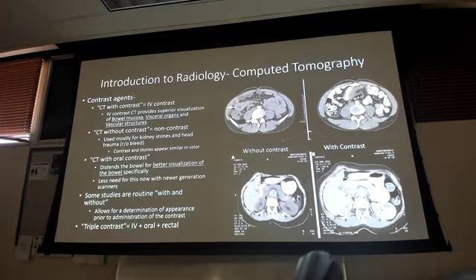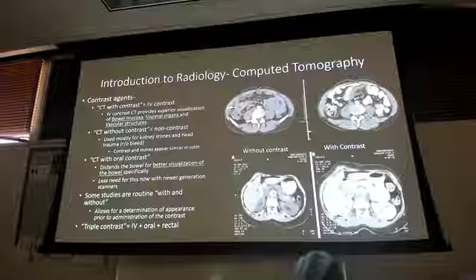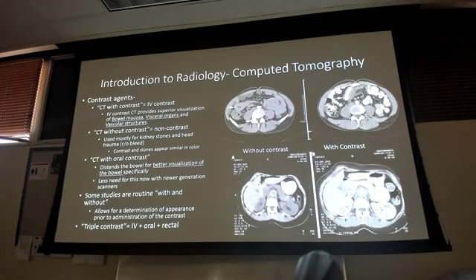CT without contrast, head trauma and kidney stone studies. That's about it. We will talk about both of those when we get to those actual areas, of why they're without contrast. Okay? Sometimes they'll do studies with and without. You don't need to worry about that yet for this course, of what's a with and without.